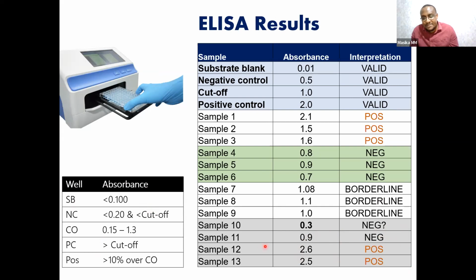So you can see by the time a lab is telling you that the patient is positive for dengue, they have gone through so many steps. So in your mind, you should be worried when there's a test or a result that is not consistent with what you expect. Then you need to think through what could have gone wrong.